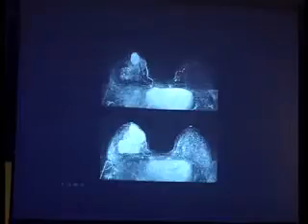Circumscribed. Okay? She's got a lot more of them here. And you see these are the subtraction images. Look at this. Six masses at least being measured. And this is several areas within this one mass. That's her most palpable, the largest, and the most anterior and superficial.